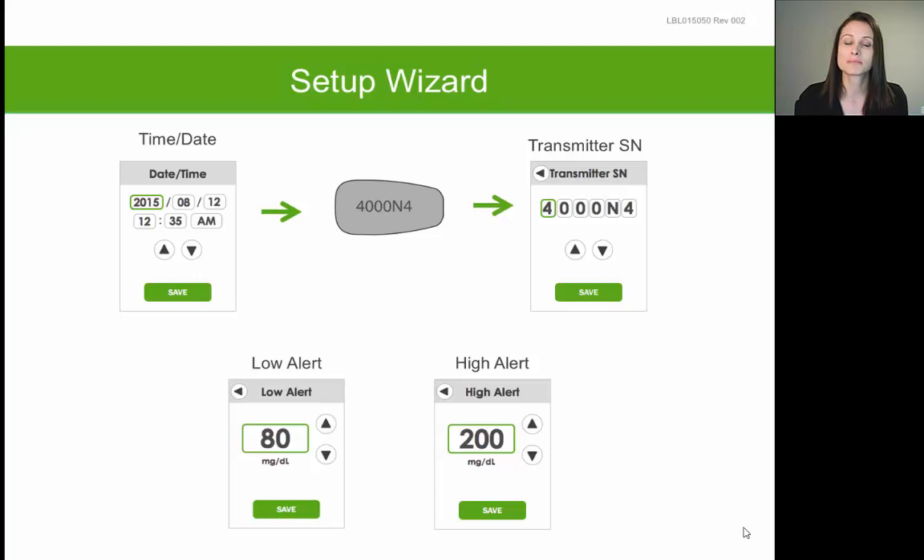Each transmitter is assigned its own unique serial number that you can find either on the back of the transmitter itself or on a white sticker on the back of the transmitter box. Your transmitter serial number is a series of six letters and numbers that starts with the number four. You need to enter this number into your receiver so that your receiver knows which transmitter it needs to communicate with.